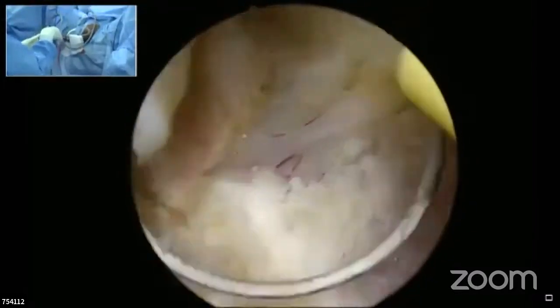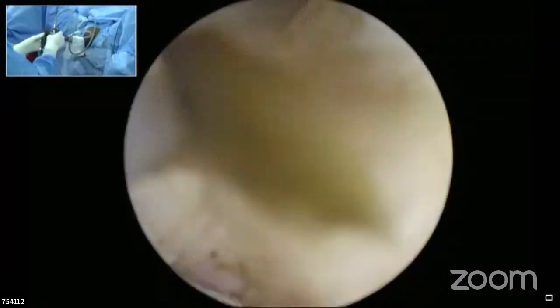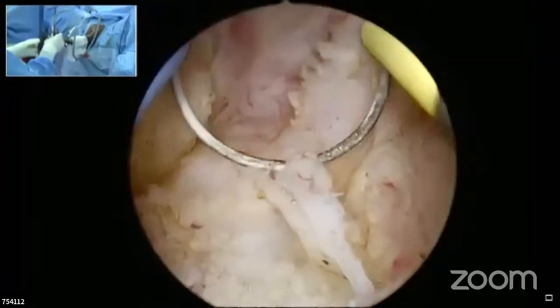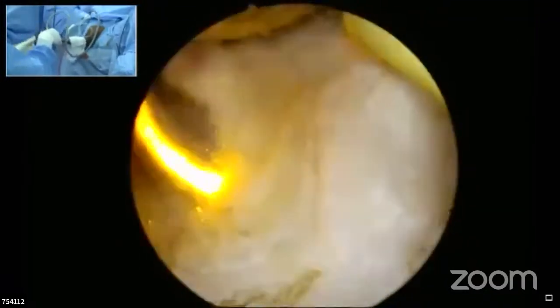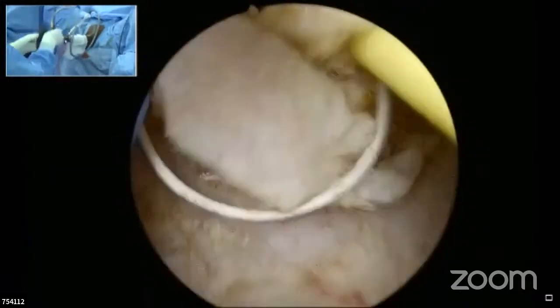If we had a chance to manage it beforehand, and if the patient is following up with us, definitely the initial attempt would be with dutasteride, sir, combination therapy. But if someone has come with retention and we don't have that opportunity to pre-medicate him, then we directly go ahead. It is a relative ease that we find, sir.